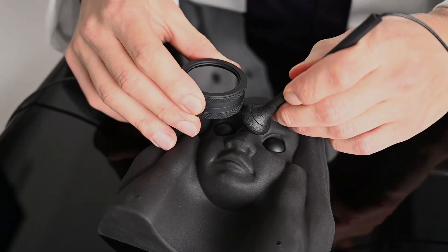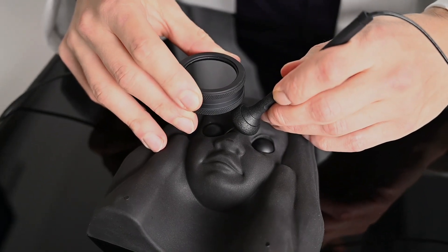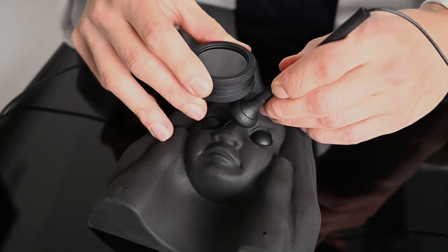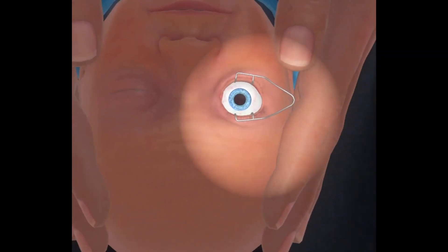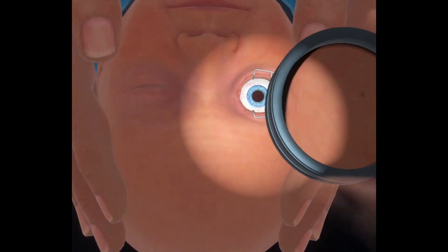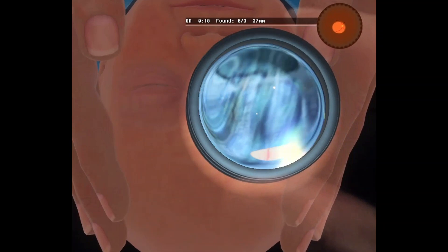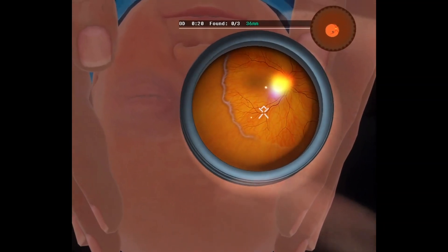When wearing the device, trainees are presented with an immersive 3D simulation of the patient. The indirect ophthalmoscope mimic and the handheld lens must be aligned precisely with the patient's eye to visualize the retina.